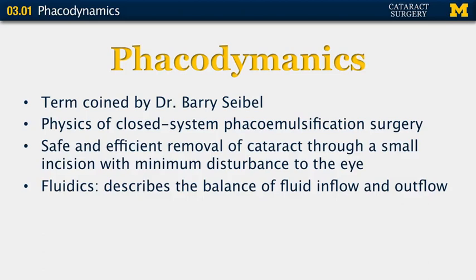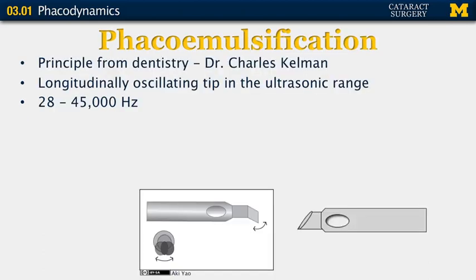A subset of phacodynamics is the term fluidics, which describes the balance of fluid inflow and outflow of fluid in the eye at the time of cataract surgery.